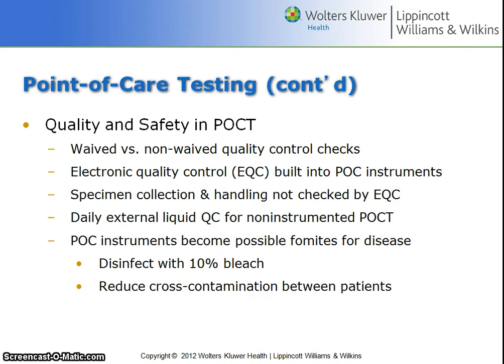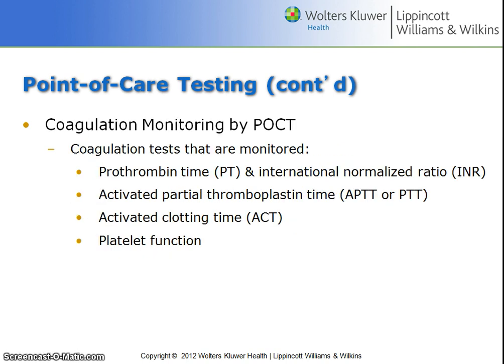Point of care testing instruments become possible fomites for disease. Fomites being something that can carry pathogens. So you need to disinfect with 10% bleach and reduce cross-contamination between patients.